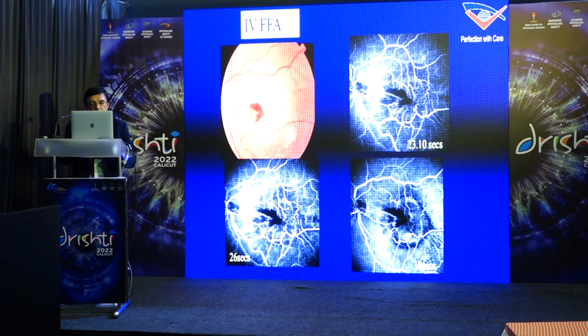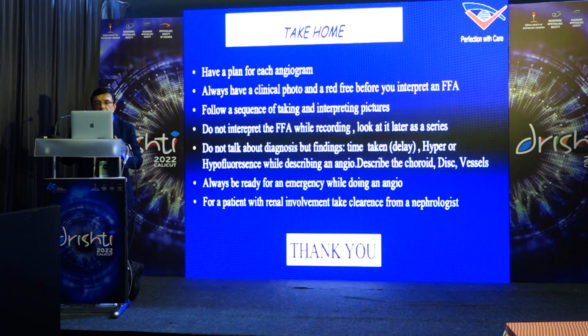Therefore, in certain situations, with an SLO-based image, it may not work very well with a normal fundus camera, but in an SLO-based system, you may be able to get a better angiogram. So the take-home message is, whenever you have to do an angiography, have a plan for each angiogram. Always have a clinical photo and a red-free, which basically means with a green filter on, before you interpret an angiogram. Follow a sequence of taking pictures.